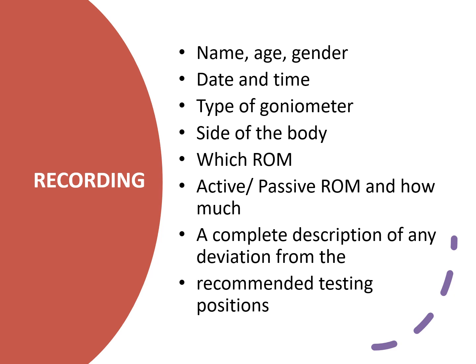Then you have to mention if at all you have used some other position to assess a particular range of motion, which is different from what has been universally followed. If you have used something else during your goniometry session for any reason, you have to mention the entire positioning, the entire description of the changed position of the technique. So please mention if you have used some other technique of goniometry.